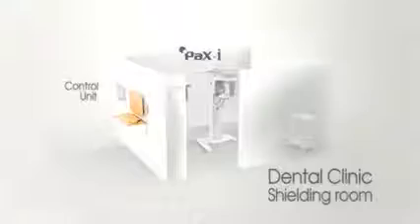Welcome to Vatek Video Training that shows you how to take the optimum images using the latest product manufactured by Vatek. Now you are watching the state-of-the-art medical system. Our latest system and control units will take you to acquire the most accurate images.